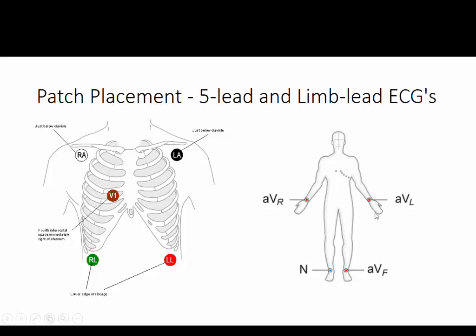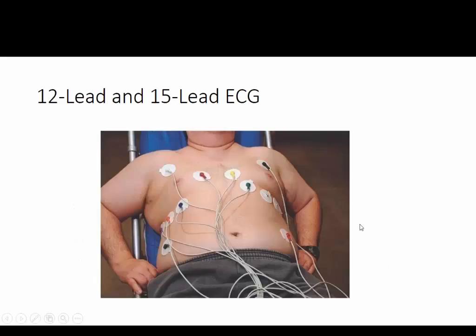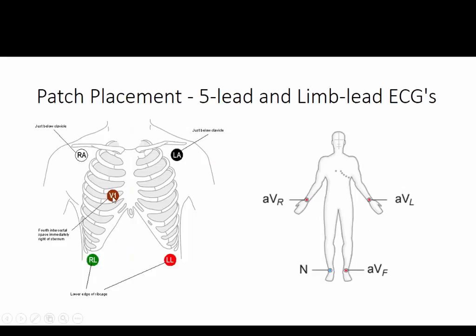What we're going to do in class today is a limb lead EKG, so we don't want to have to put stuff on the surface of your skin. We're just going to use your wrist and your ankle area.